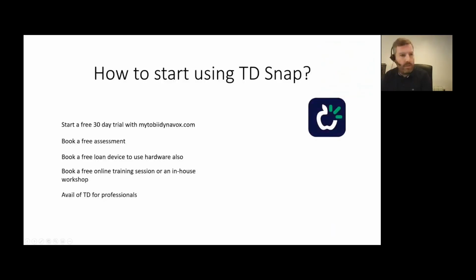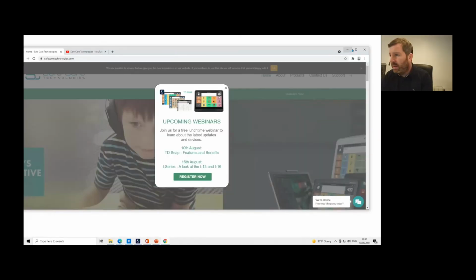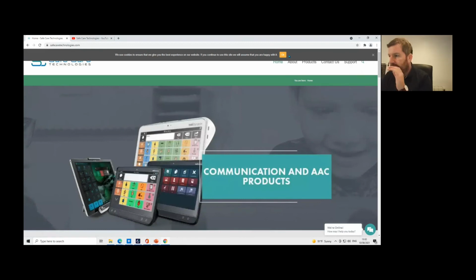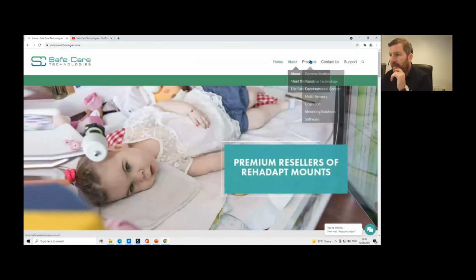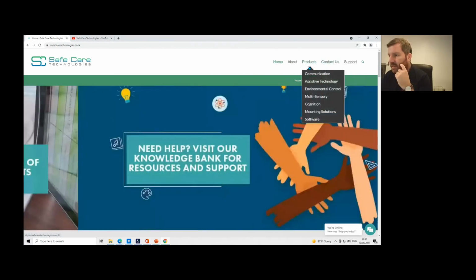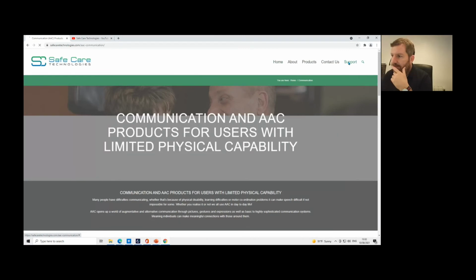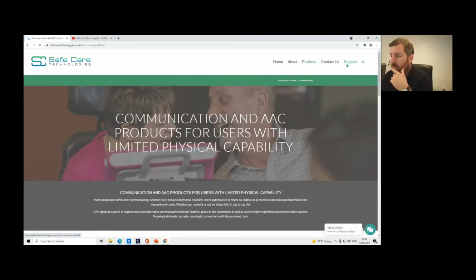One other thing I wanted to show you was some of the resources that we have. If you go to our website, safecaretechnologies.com, you can go in and look at the products, and in the product section you'll find TD Snap under communication. But in our support section, if you hover over that, there are two options: you can go into the support section or AAC for Professionals.